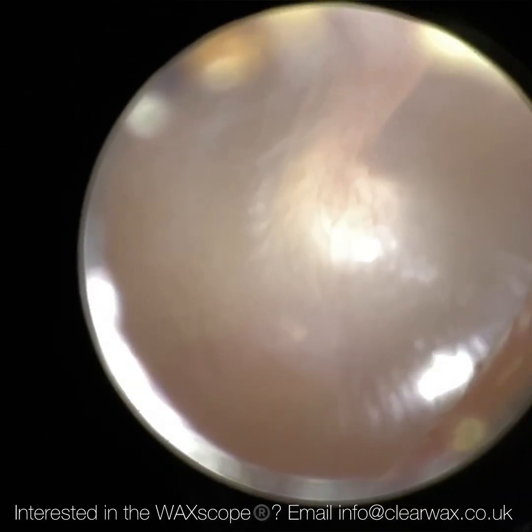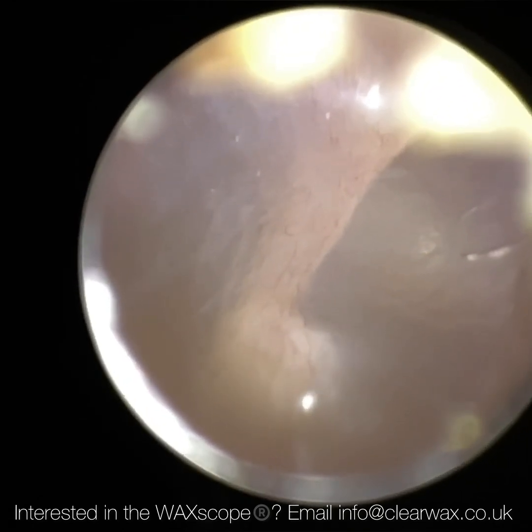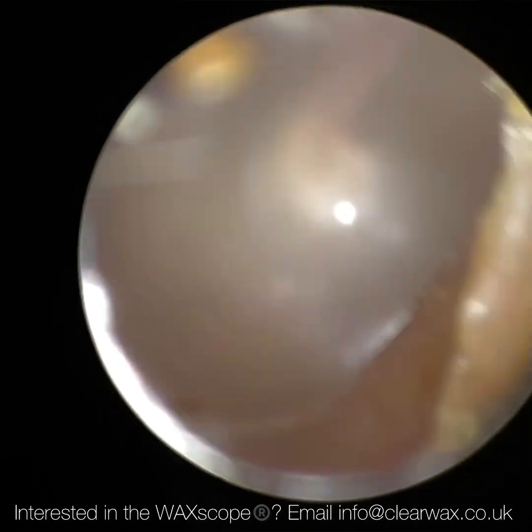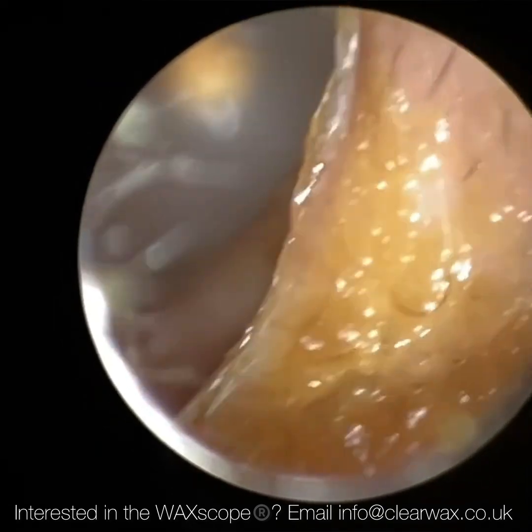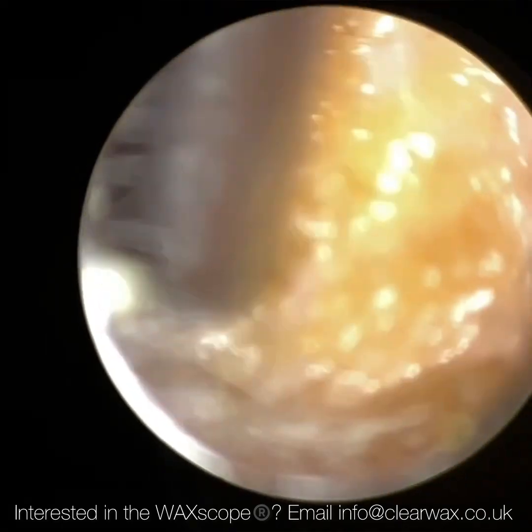So, just visualizing the patient's umbo, this is the center of the eardrum. You've just got it in focus. You can see all the blood capillaries. You can even see all the fibrous connective tissue and the fibrous stratum layer, which is the middle layer of the eardrum. The eardrum's three-ply thick.